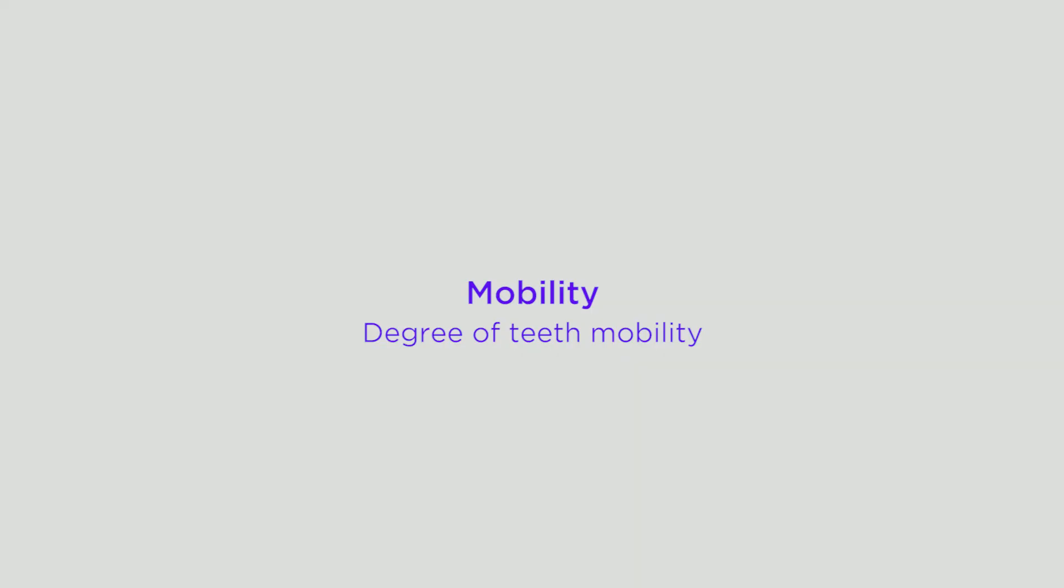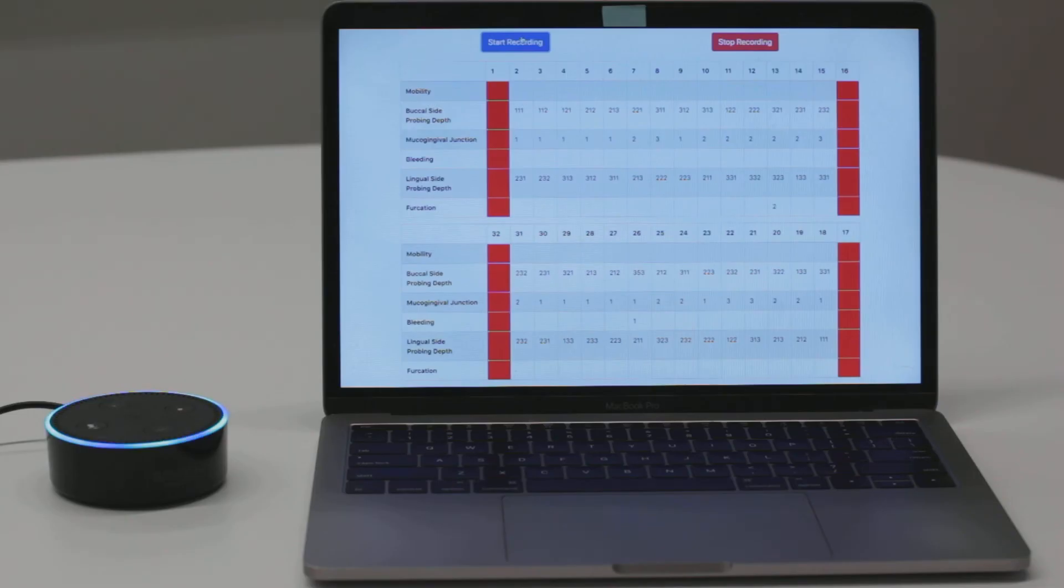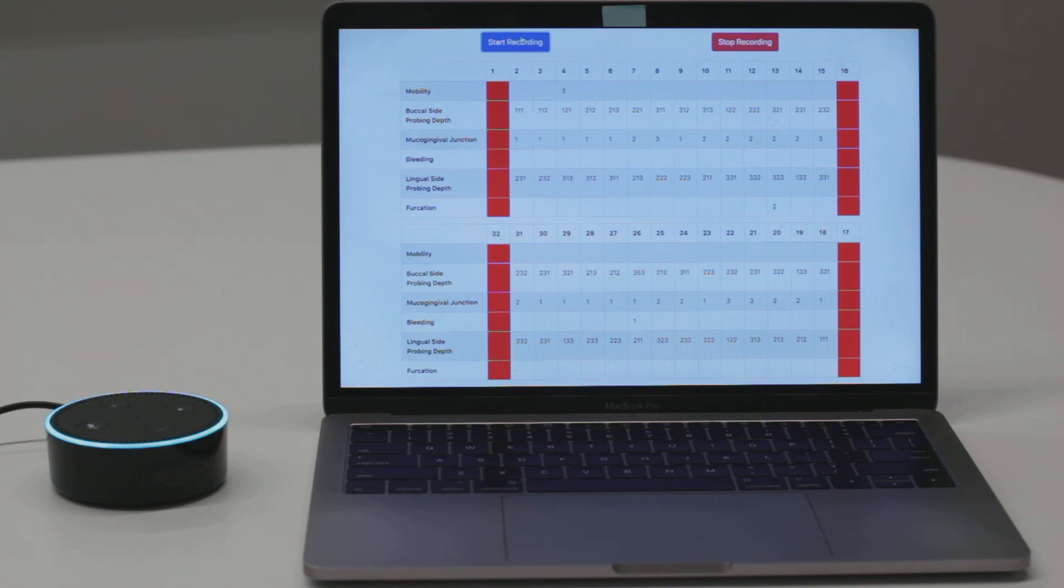Do you want to record the mobility? Yes. Okay. You can begin recording the mobility now. Number 4 plus 3. Mobility recorded.